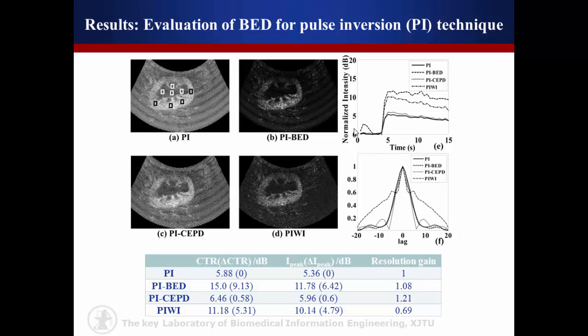CEPD enhanced the resolution. However, the CTR of CEPD had only slight enhancement. PIWI improved the CTR, but lowered the resolution. BED improved the CTR significantly while maintaining a good resolution.